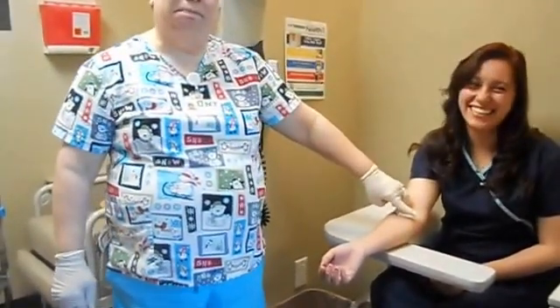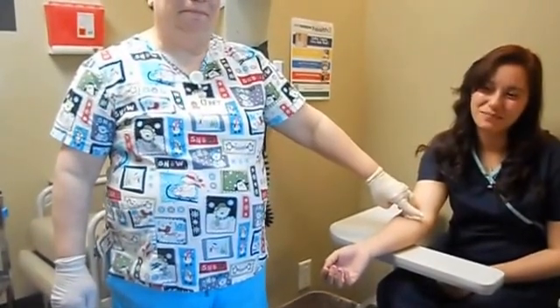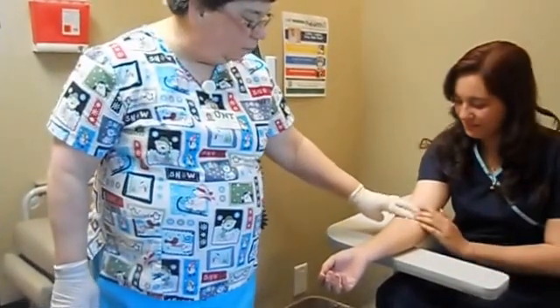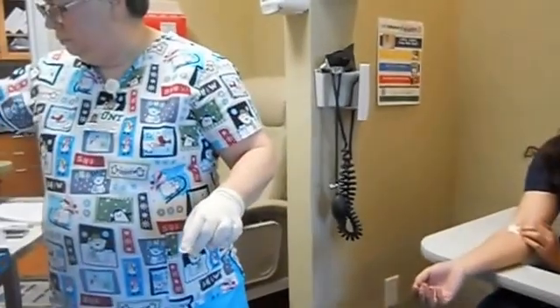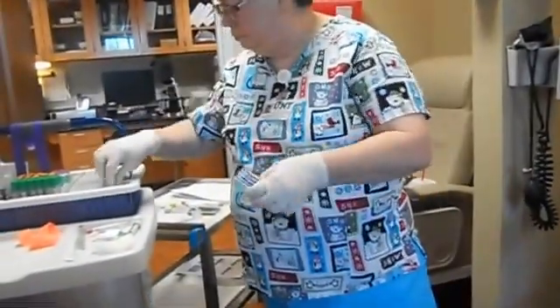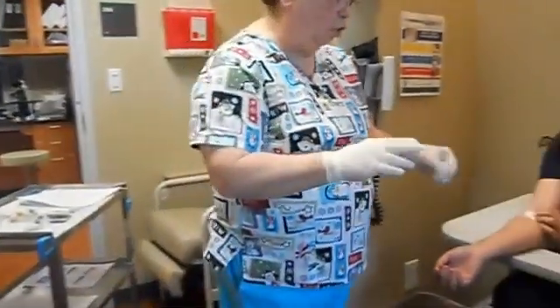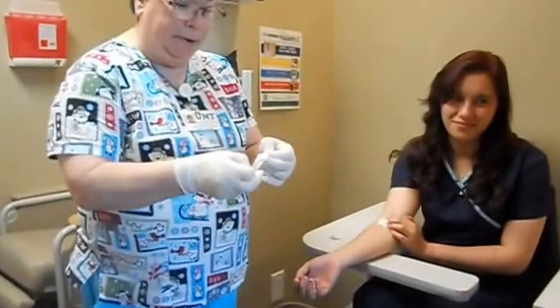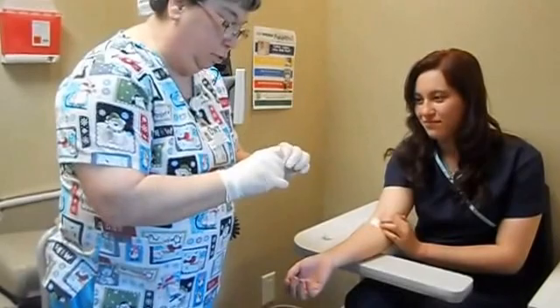This one is. Can I hold it for me? I'm going to Band-Aid. So that is from tourniquet to Band-Aid, the perfect phlebotomy. But that, like I said, phlebotomy doesn't just include venipunctures.